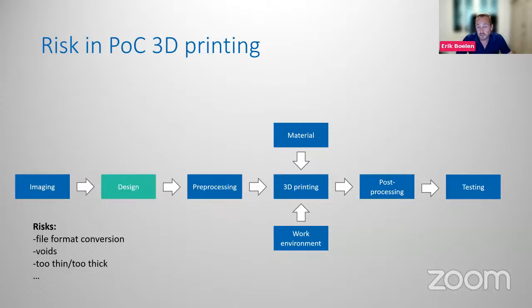Then if we go to design, I know that many people are using various software packages in a row. So be careful about file format conversions if you're going from one software to another and back again. Take care of that.